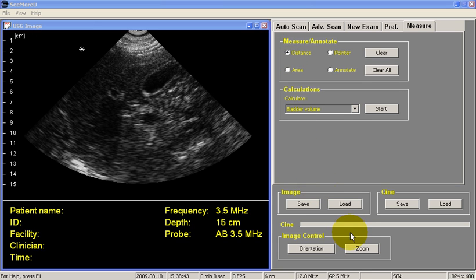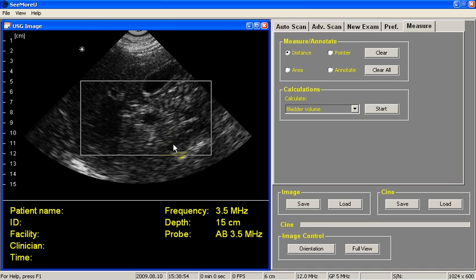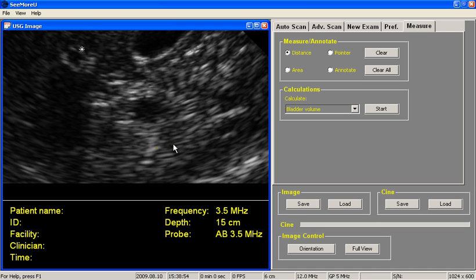To zoom, we click on the Zoom button, left-click on that, put the cursor over the region of interest, and we left-click the box to the area we want to magnify, release the button, and we can now see the area of interest. I can measure distance even on a magnified image by dragging the cursor.